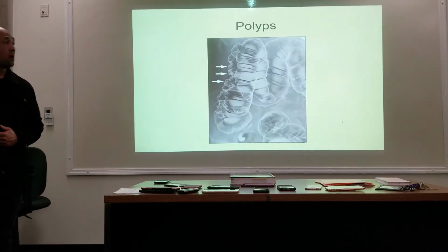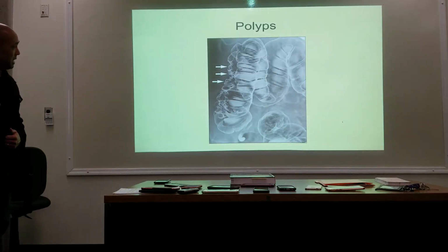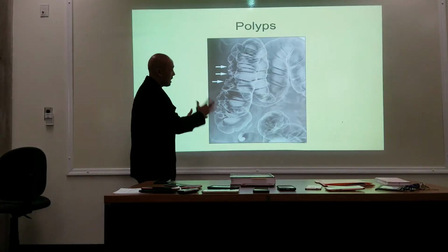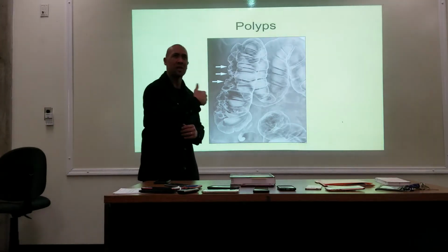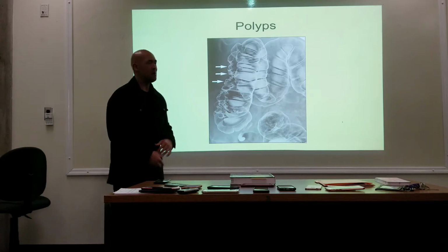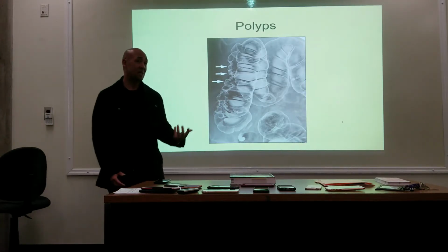All right, then here's polyps. They're in-pouching. And so this is why a double contrast study is really good. Without filling it, you have just enough barium to coat the lining, and you can see the polyps. But if this was filled up with barium, now it's hiding.